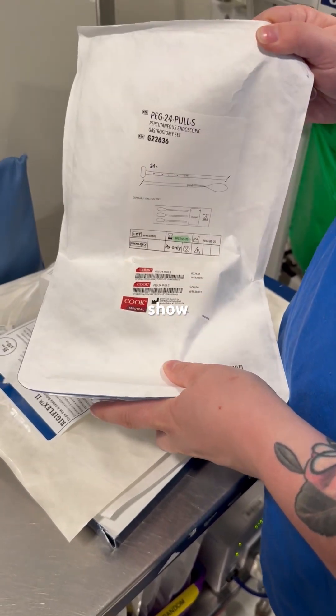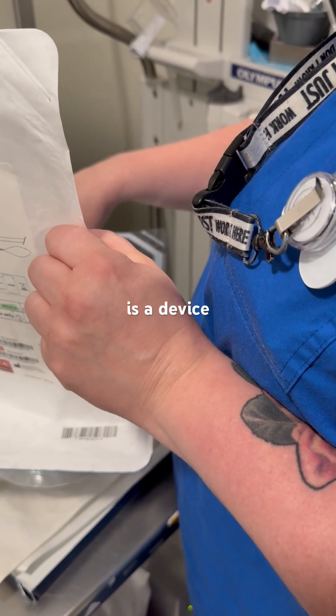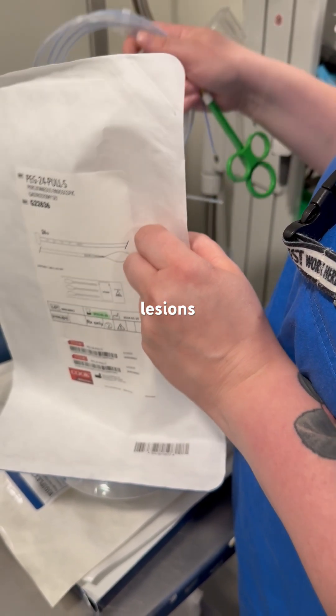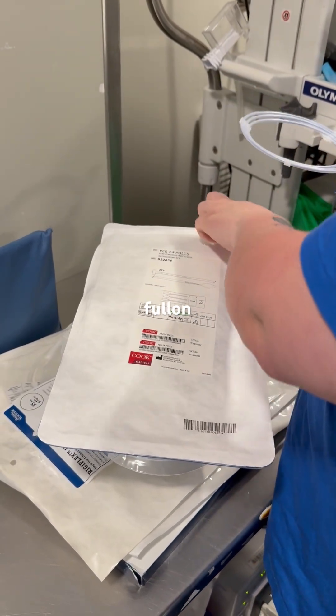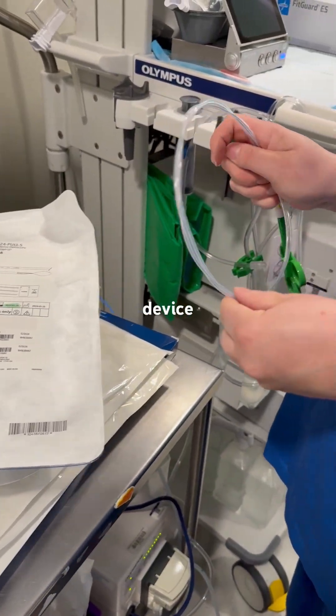We are going to show how to use a snare. The snare is a device that is used to remove lesions. It may be seen in the stomach or the colon. We are just going to have a quick demonstration of this device.